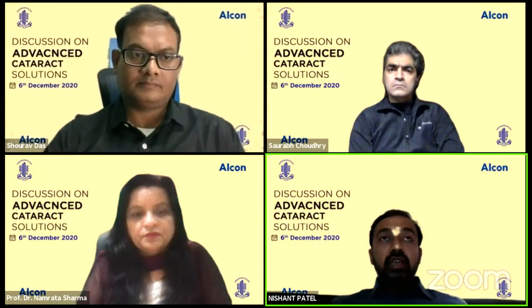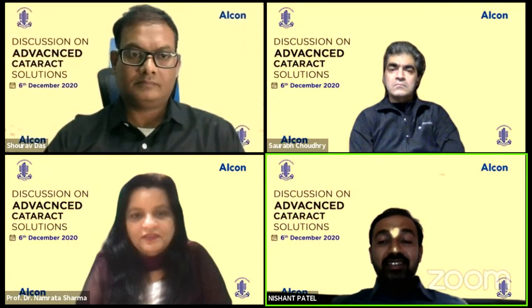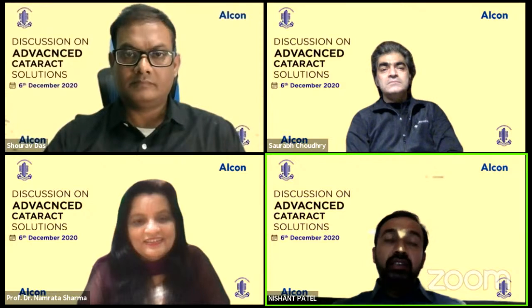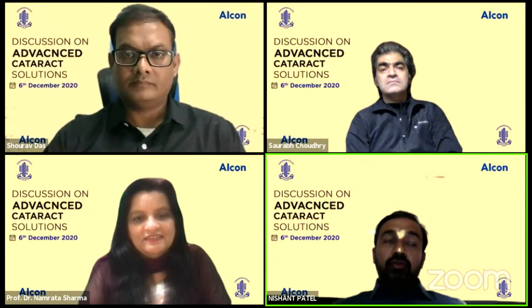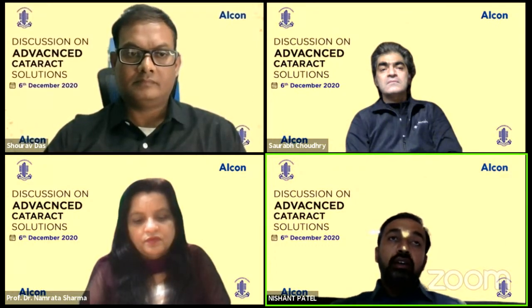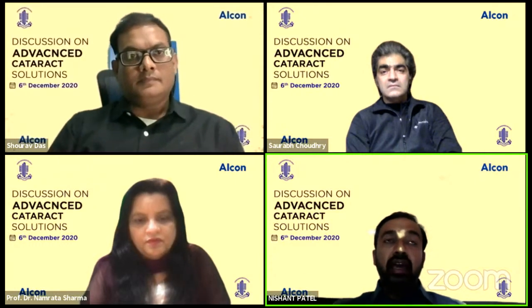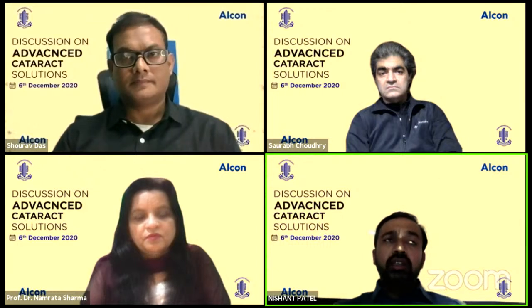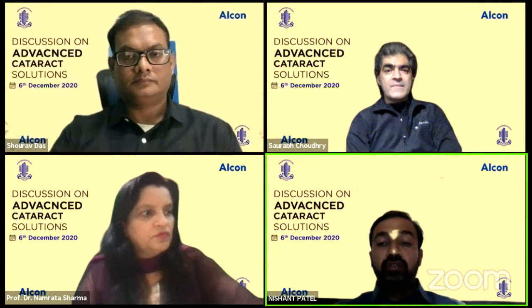Ma'am, why not? These are the ideal patients actually. All their daily chores probably require different ranges of vision, different activities, right from cooking, say separating grains, to cutting vegetables. I have known family members who are into knitting, so their hobbies are also certainly important. A homemaker would be an ideal patient for any kind of presbyopia-correcting IOL, and specifically a trifocal IOL, because we are not worried too much about the nighttime photic phenomena.